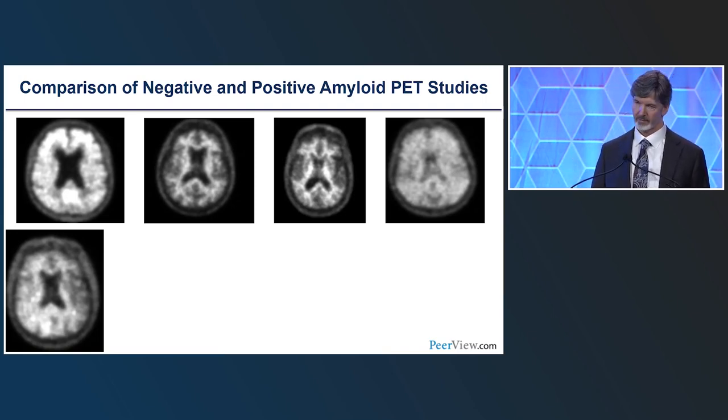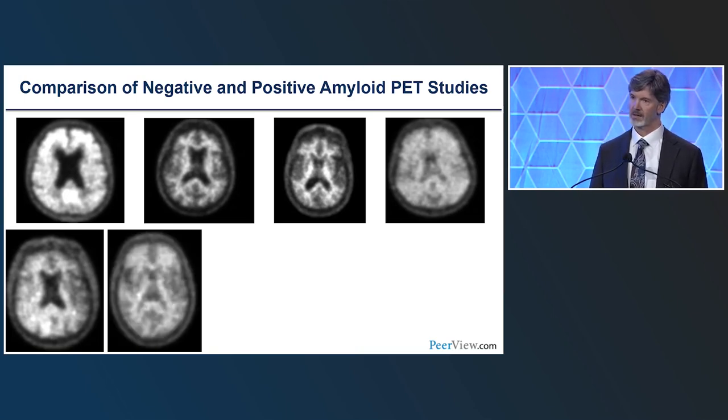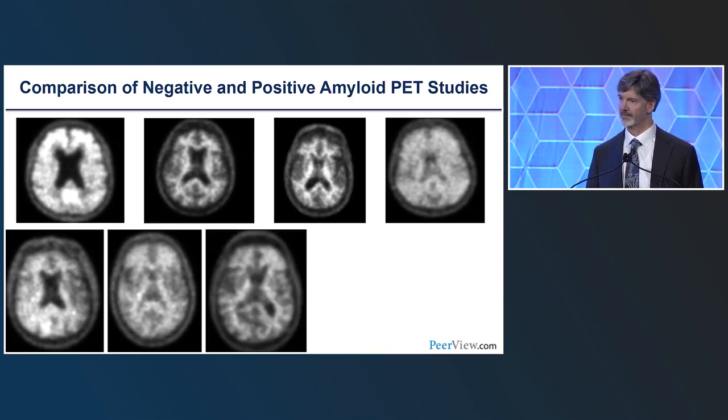Okay, how about this case? You're right, positive amyloid scan, but not entirely homogeneous, only regionally. How about this case? You don't see the great separation between white matter and gray matter, right? Positive. What's this? Regional positivity, where you don't see it everywhere, but this is also called positive by most of the interpretation guidelines you'll see, and it's also indicating amyloid.